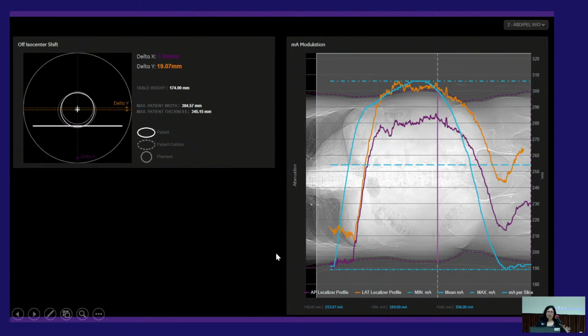So these are all kind of cool things that otherwise, to do this manually would be a real painful process, right? I would quit if I had to do this manually. So having Dosewatch or Radometrics, I'm sure Radometrics has the same thing, right, Sam? I don't have Radometrics, I don't know, but I would think they do as well.